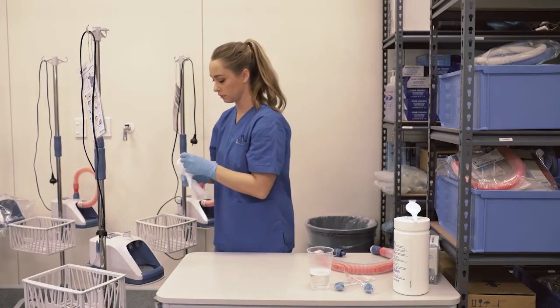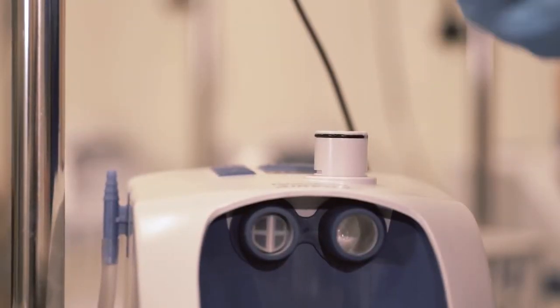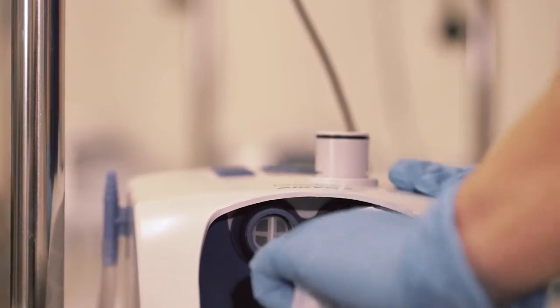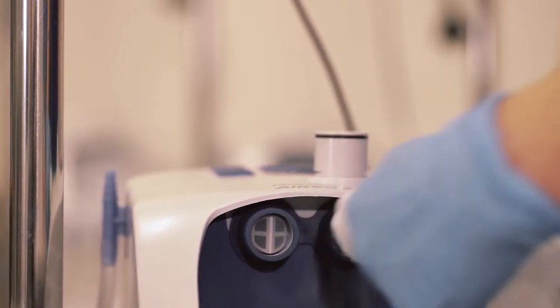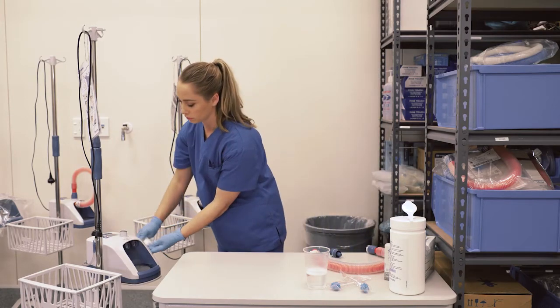If using a disposable cloth, thoroughly clean the outlet elbow from both ends as far as possible, continuously rotating the cloth with your finger. Then use an alcohol wipe or apply an alcohol solution to a clean damp disposable lint-free cloth to wipe the outside surfaces of the unit.